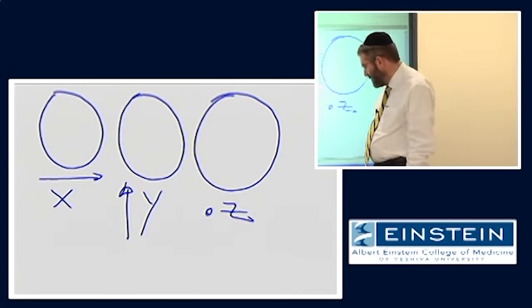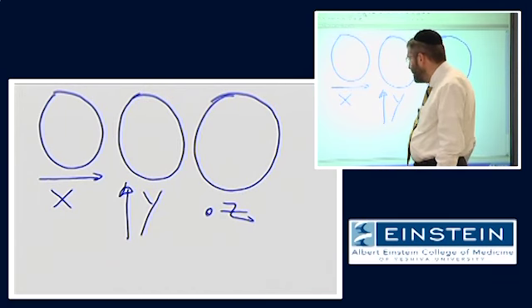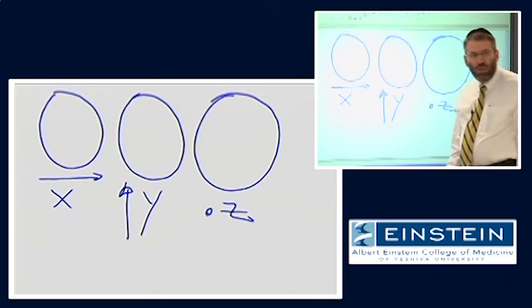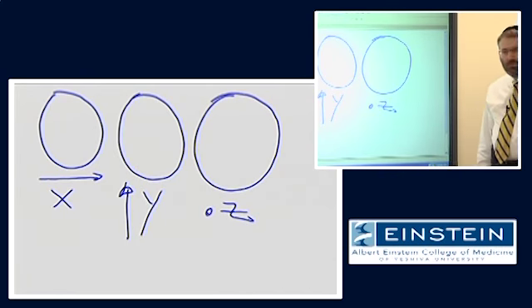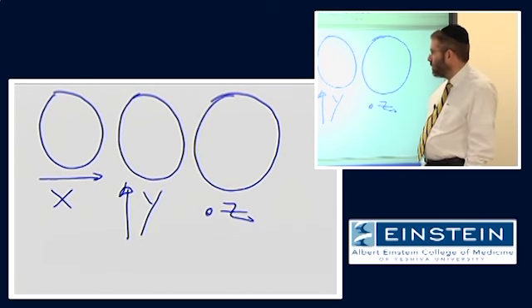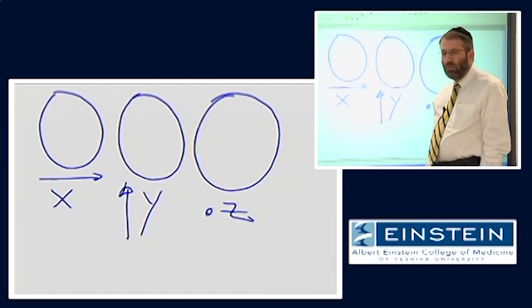So if I asked you to indicate on this image on the left, where would we have the highest signal amplitude? Where would we, on this diffusion-weighted image, sensitized left to right, have the highest signal?